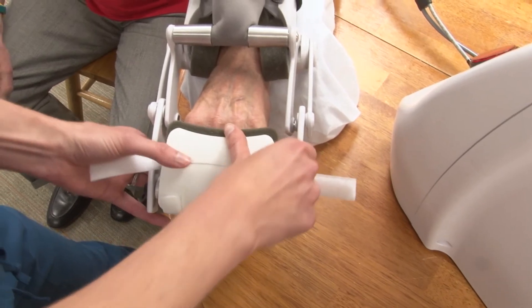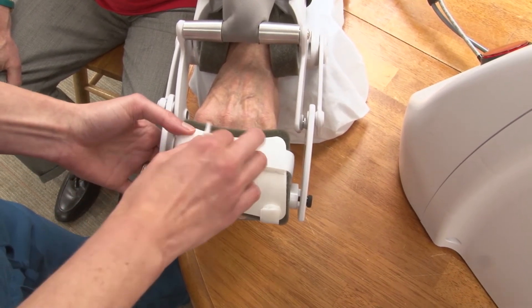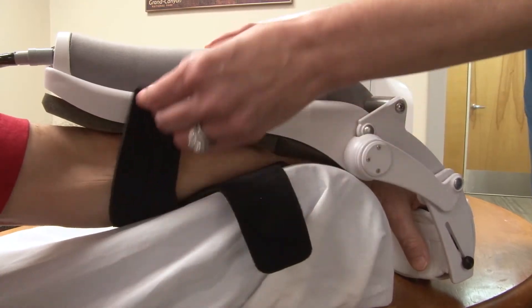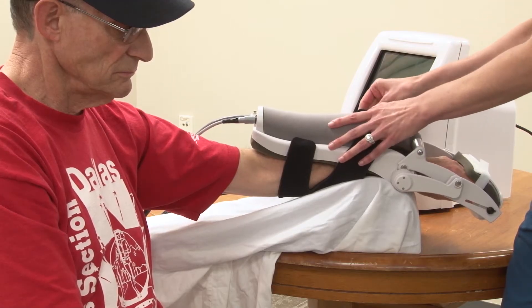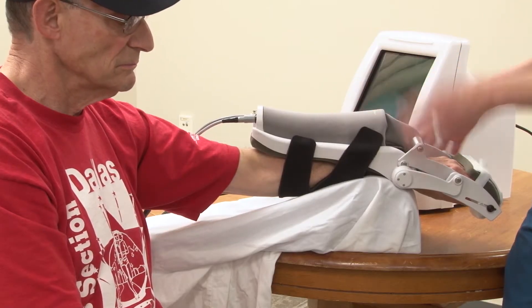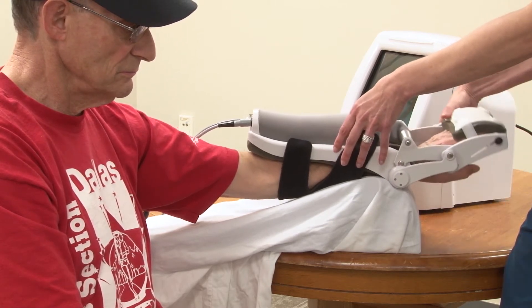Once that's lined up, affix the foam finger support and gently strap that down — it should be firm but not constricting. Then attach the volar strap to affix the forearm of the Hand Mentor. This again should be firm but not too firm. Please confirm with your patient that this is comfortable and not too restrictive. Once done, confirm that the device works in full flexion and extension.